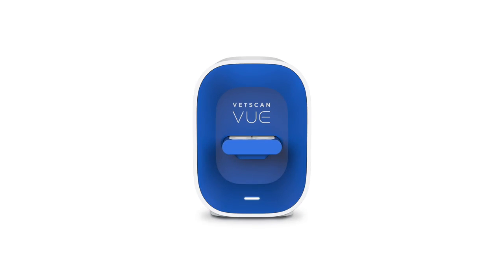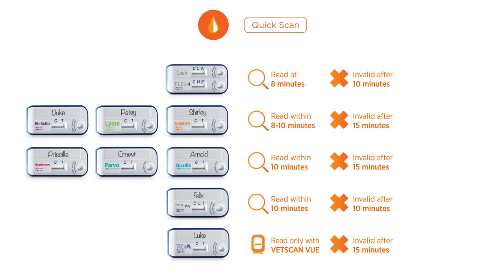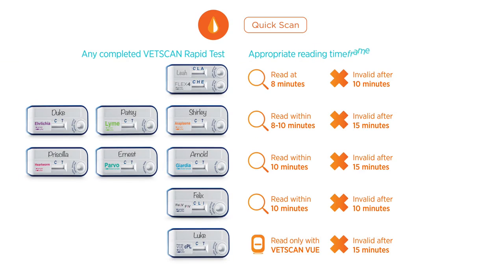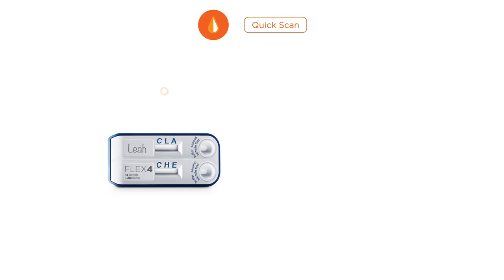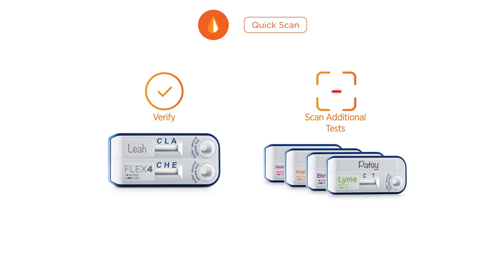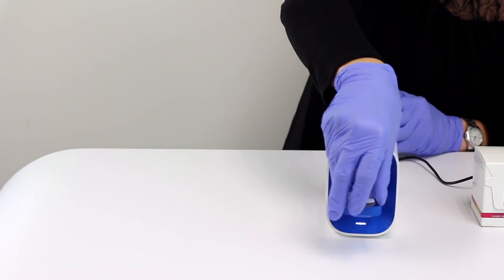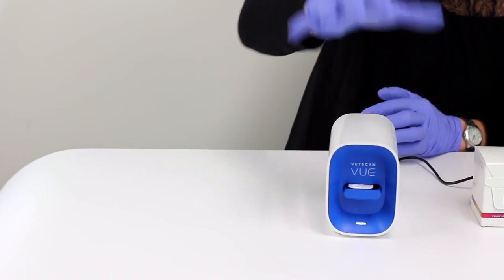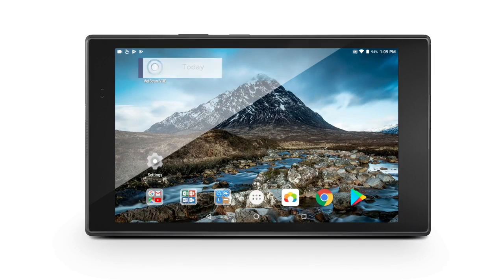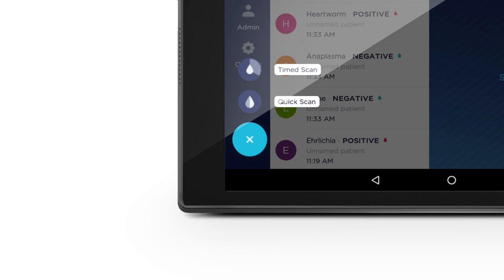The VetScanView also offers a QuickScan function that can be used to immediately interpret any completed VetScan RapidTest during the appropriate reading time frame. Use the QuickScan function to verify a test that has been manually read or to scan additional tests quickly, one after another. To perform a QuickScan, insert the test into the VetScanView Analyzer within the appropriate reading time frame.